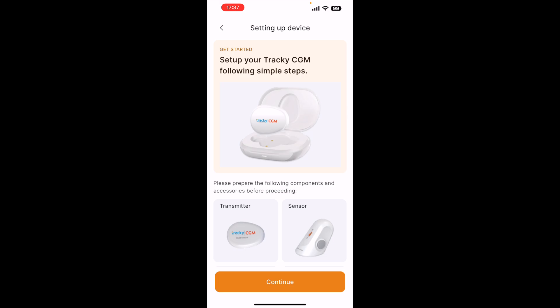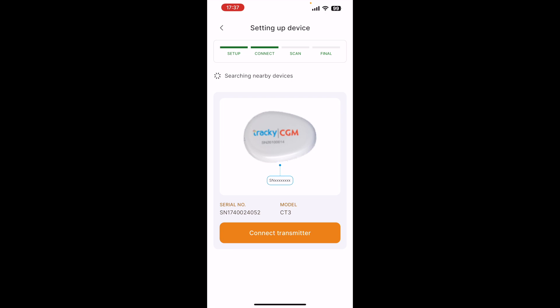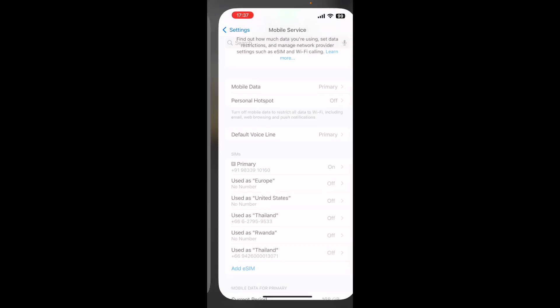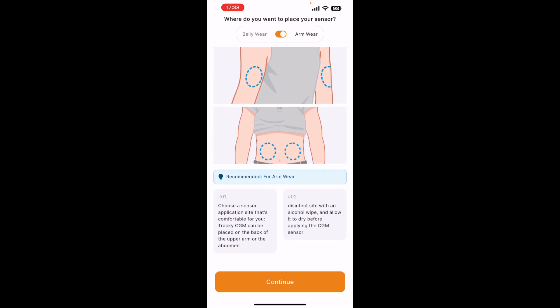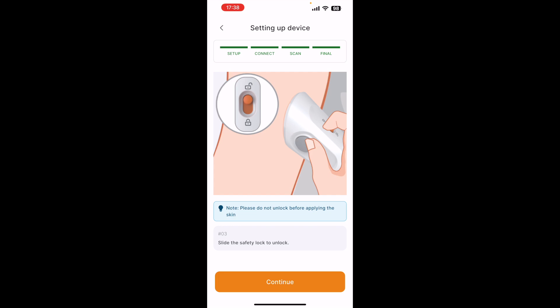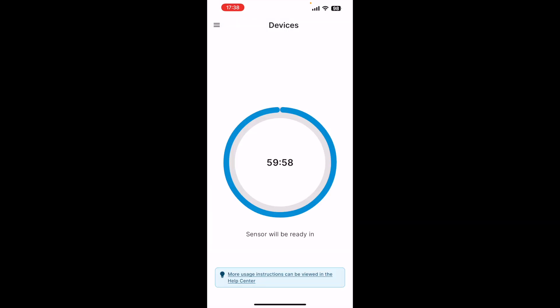I'm going to press 'Get Started' and it says you need to set up your Tracky. You can see there are four steps at the top: Set Up, Connect, Scan, and Final. I'm going to go ahead and press Connect, and say OK for scanning the QR code. I've scanned the QR code and it tells me to move to the next step: 'Where do you want to place your sensor?' I've already worn it on my arm, then press Continue. It tells you how to apply the sensor, and now my sensor is going to be ready in the next hour — it will be activated in 60 minutes.